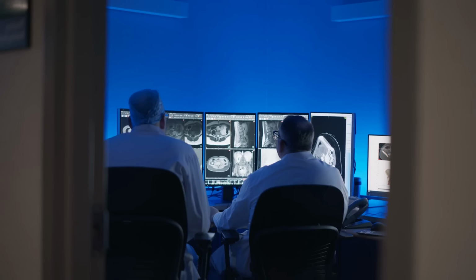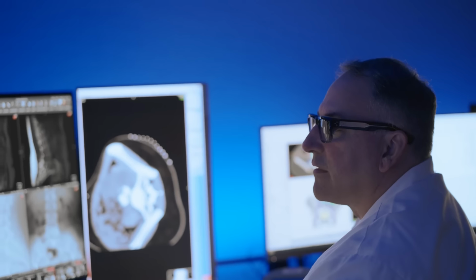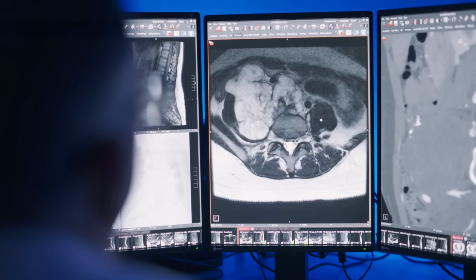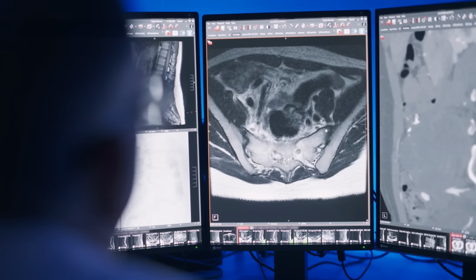So you can see that there's a large tumor. You can see how intimately the vessels are draped over the front of it? Right, that's going to be the biggest problem for us surgically to take this out, is going to be the vessels. So what do we see about the relationship of the aorta and the cava?